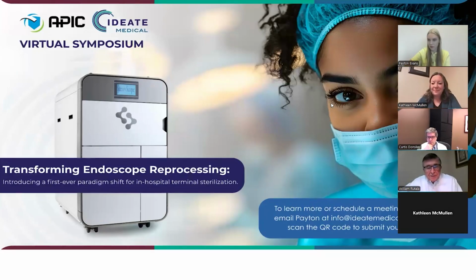Certainly, since approximately 11 years ago, when we published a paper in JAMA, we have been encouraging the transition from high-level disinfection to sterilization. Of course, it is challenging to sterilize endoscopes with long, narrow lumens, but certainly it's not impossible, as demonstrated by the fact that Dr. Donskey has done studies and published those studies in Infection Control in 2025.